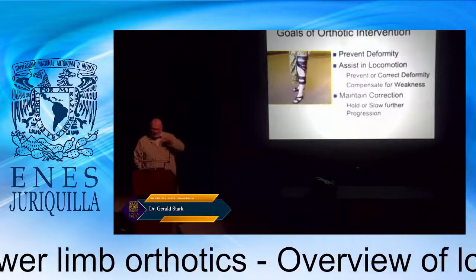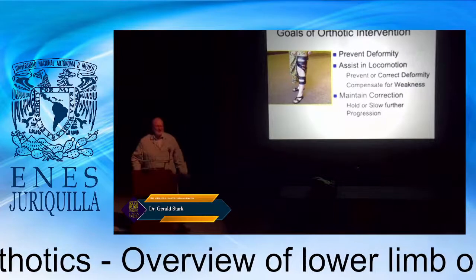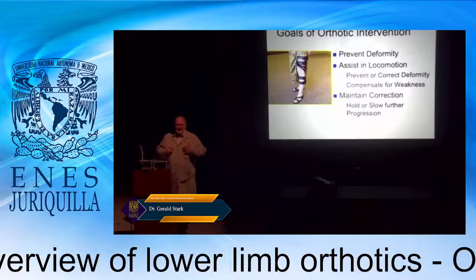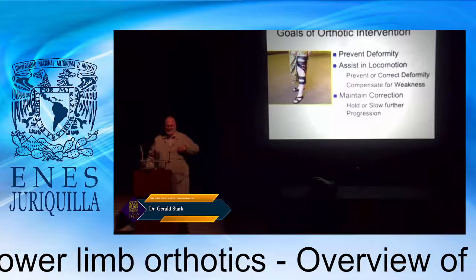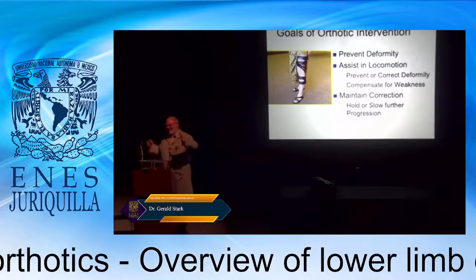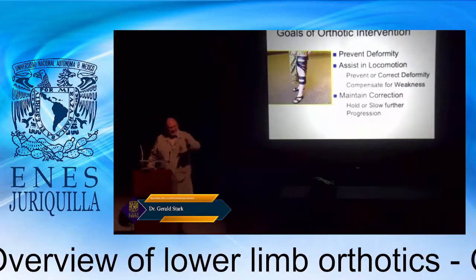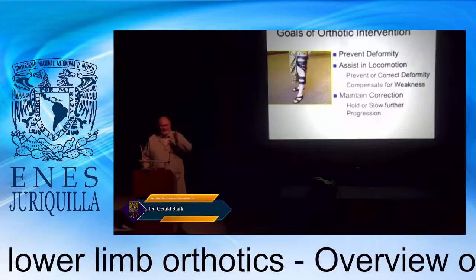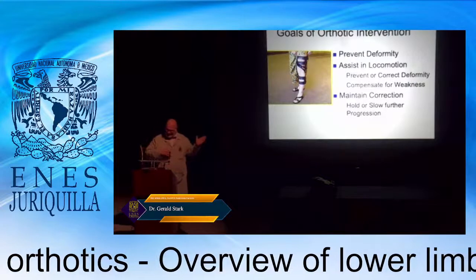So we've covered quite a bit in terms of this overview of orthotics. And if you're a little confused, that's okay, because there's so many things to know. And as an engineer, I have to say orthotics can be very frustrating because as a prosthetist, it's very easy for me, an engineer, to replace things, realign things, and away we go. But with an orthosis, I have the leg to deal with. And many times that mechanical system is imperfect and getting worse over time. And my goal is to stop this bridge from falling into the water.